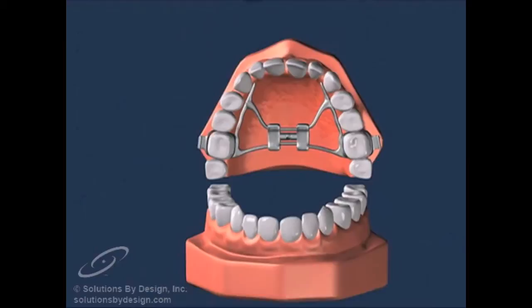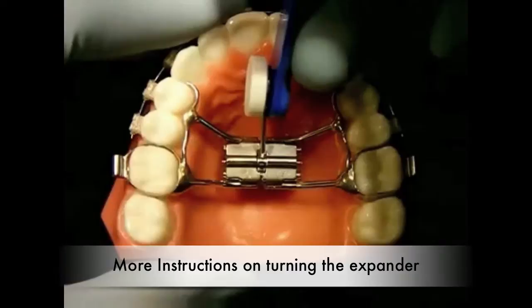Typically, you will rotate the screw in the expander to the point where you can see the next slot or hole. Your orthodontist will also give you a key to turn the screw. You will need to turn the expander yourself or have somebody else turn it for you.